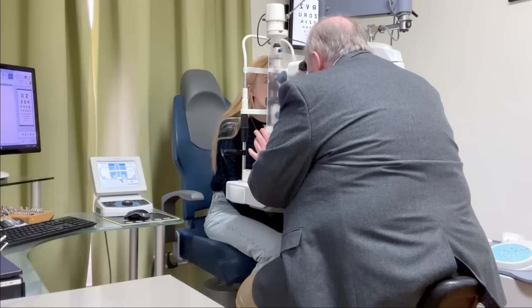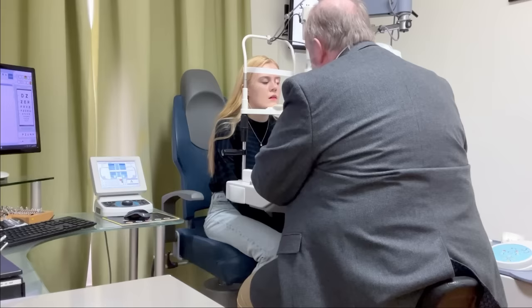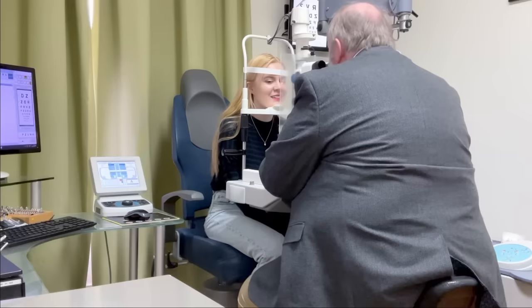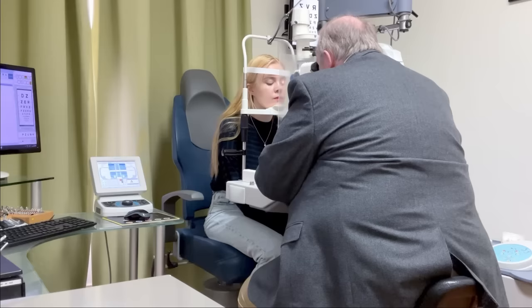Have you noticed a little bit of pigmentation at the edge of your eye on this side, at any stage? What does that exactly mean? Like colours? Yeah, just a little brown mark at the edge of the eye there. I don't think so, no. Not being aware of it? Okay. I might just not be aware of it. Okay. Let's have a look at this one. I thought it was makeup in my eyes. Okay. Look up for me. And look down. Straight ahead again.